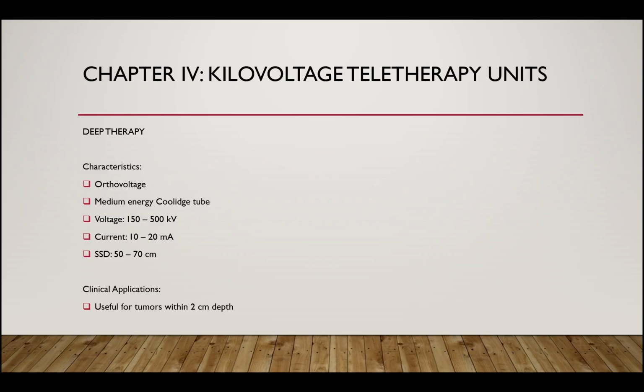Cones can be used, okay? Cones to collimate the beam into a desired size. A movable diaphragm consisting of lead plates permits a continuous adjustable size. So, parang sa collimator din na X-ray machine natin, no? So, the SSD is usually set at 50 cm. Okay, 50 to 70 cm. Yun yung range natin ng SSD.